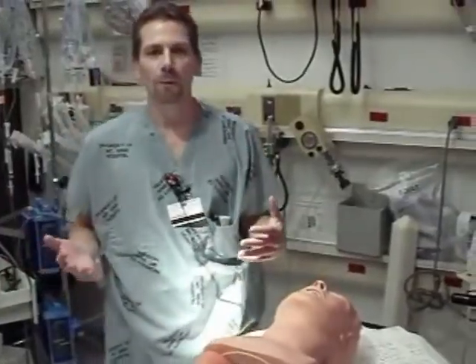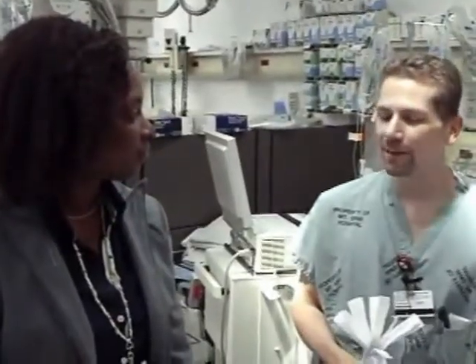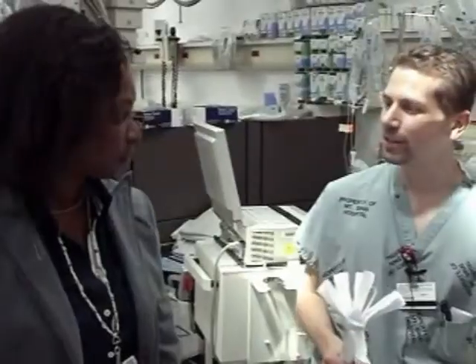Hopefully we'll get a volunteer in here and we'll show you what sniffing position is. We have Ms. Clark, one of our excellent administrators here at Elmhurst, and she's going to help us out. We're talking about good and bad sniffing position. First, help me demonstrate bad sniffing position.